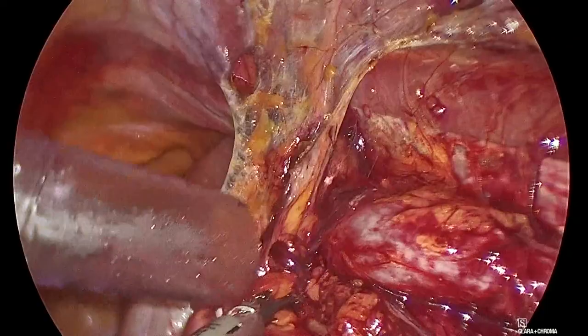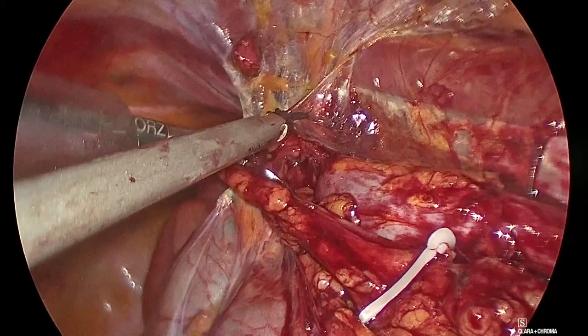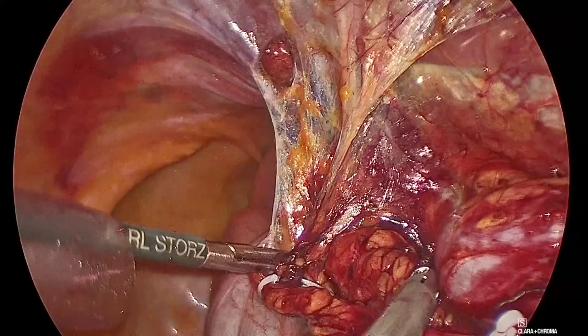So here I'm very low, so can we retract the trocar a little bit? Can you push the trocar back a little bit? Thank you. Okay, so here I'm really at the level of the iliac vessels, okay? The iliac artery is right there. You see it? That's the iliac.